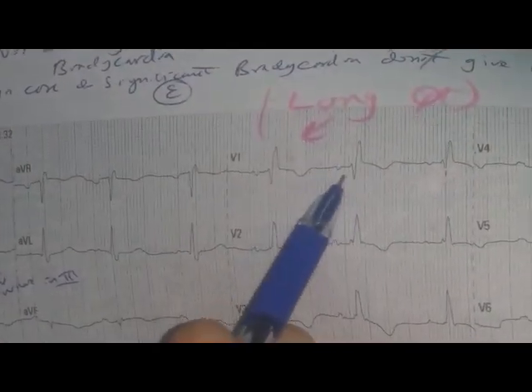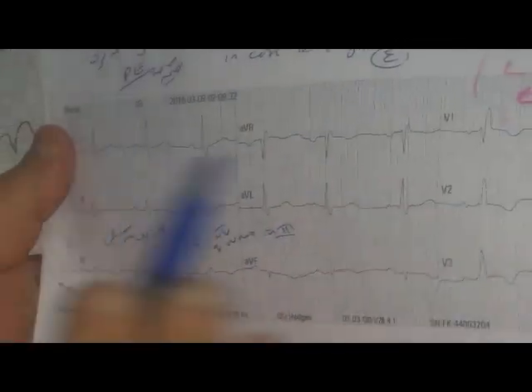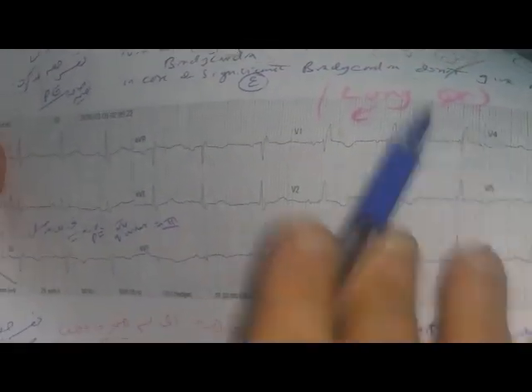She has complete AV block. This is the resting ECG showing right bundle branch block, first degree AV block, and left anterior hemiblock. She has three types of block in one. She is risky.